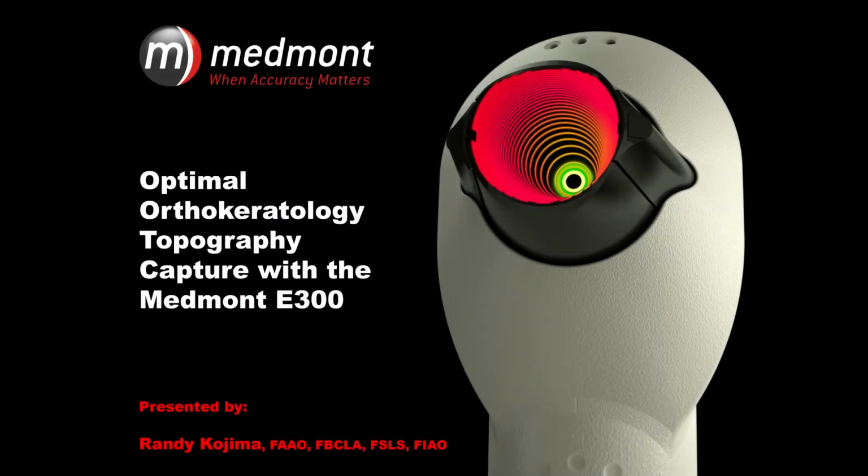Welcome to this orientation on the Medmont E300 Corneal Topographer. We're going to talk today about optimizing the topography capture, more specifically toward orthokeratology. This session will start with very fundamental information for new users, but we're going to move on to more advanced concepts for those practitioners with a lot of experience with Medmont and ways to improve efficiencies.